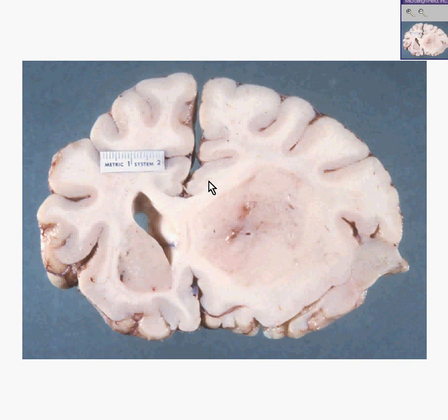Grossly, you can see here that there is just something in this basal ganglia area that is very subtly differentiated from the surrounding tissue. It would be very hard for me to put the arrow on the tip of the tumor and say, well, here is the margin, because as you saw microscopically, it wasn't really a fine margin, was it? It was a very subtly blending in kind of a tumor. And that's classically what these low-grade astrocytomas, often generally called gliomas as well, look like.